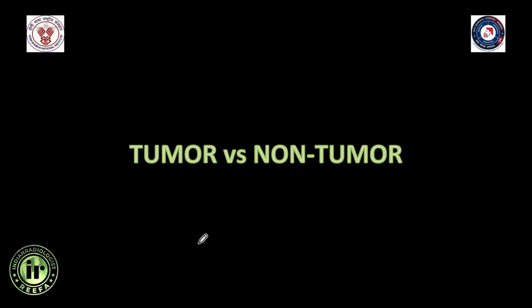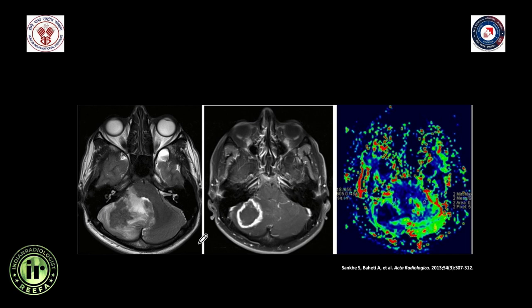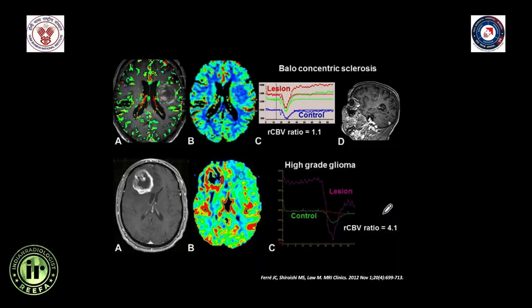Moving on to diagnosing tumor versus non-tumor pathologies: this example shows a lesion with central T2 hypointensity, peripheral rim enhancement on post-contrast T1, and hypoperfusion on perfusion imaging — implying a non-tumor pathology. This was a tuberculoma.